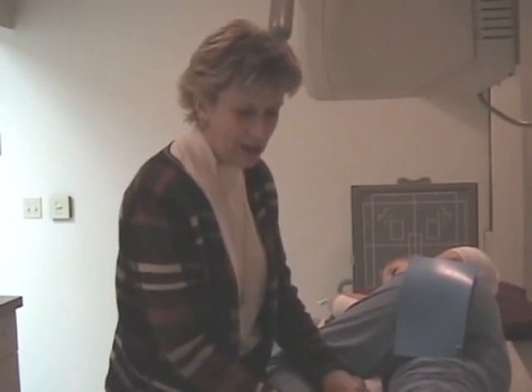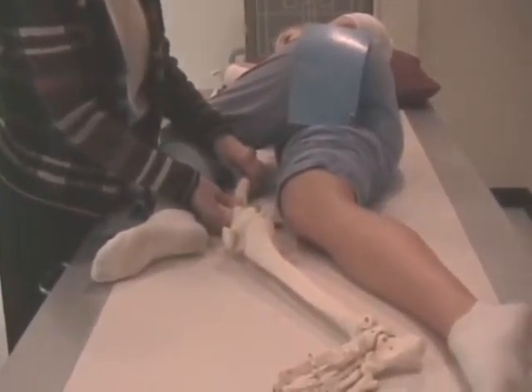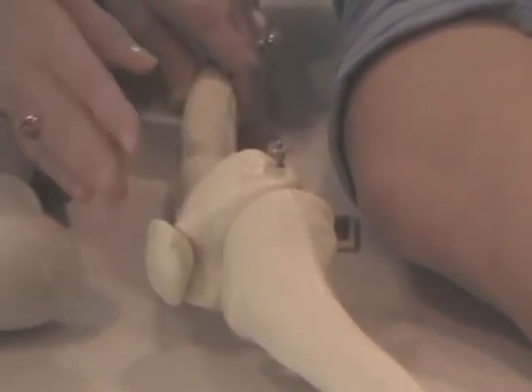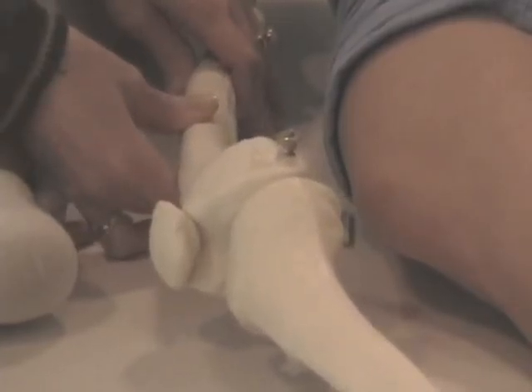We've added a little prop to our setup here. If you take a look at the table, we have a skeleton part here to help demonstrate a knee in a true lateral position. You're not going to see the patella away from the femoral condyles just because of the way the skeleton is constructed, so you are going to have to do a little bit of imagining.